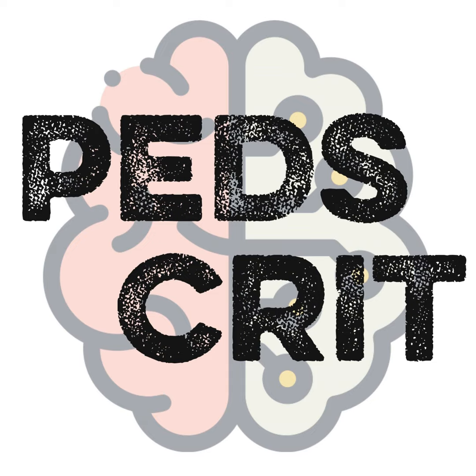For a VV patient, it's actually a little easier to trial them because you don't have to clamp the circuit in VV. If your patient has evidence of tidal volumes, chest rise, is able to get a tidal volume that's 4 to 6 per kilo on what are either rest settings or lower, I actually like for them to do this on extubatable settings. I definitely get some flak for that because people like to get off as soon as they possibly can. But I went through the pain and process of getting the patient on ECMO. I don't want to take them off until I know they're better.